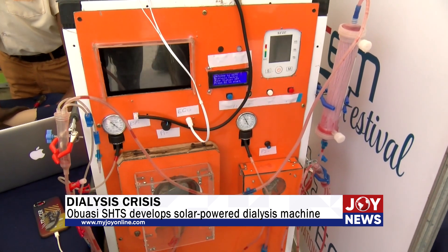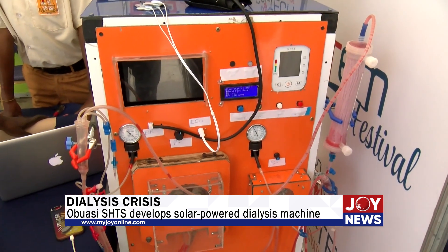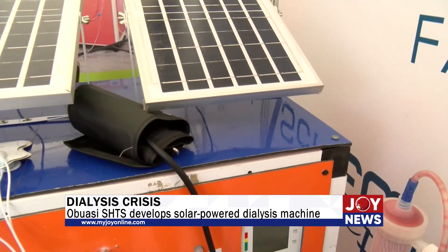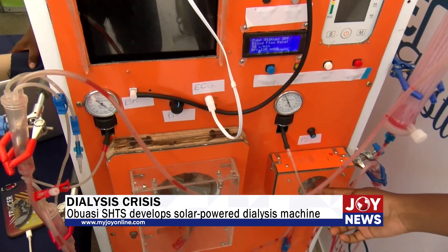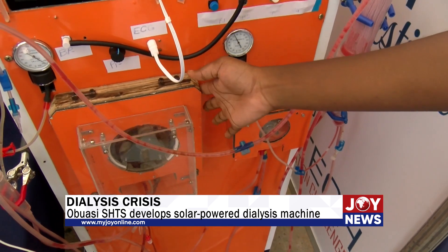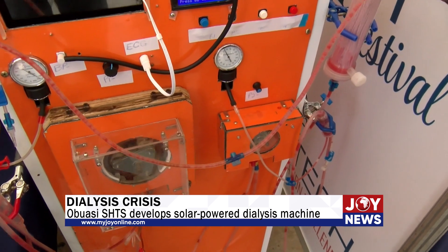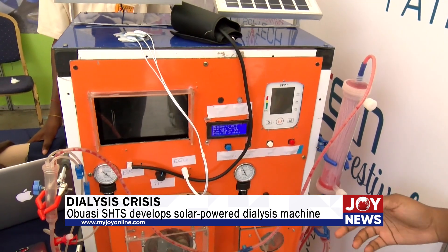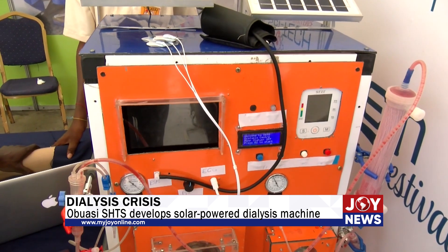I'd like to hand over to Pressler to help us with the whole operation of the device. But before Pressler comes, what were some of the items used to build this solar powered dialysis machine? This board is a local board. The dialyzer and the tubes we bought them. We built parts of it in our school. We have blood pressure sensors, we have electrocardiogram, and we have these buttons. So most of them were locally sourced.